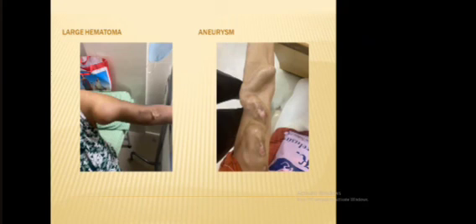This is another patient referred from another place, showing a severe aneurysm of the AV fistula. He came to show this and ask what the problem is, whether you want to close the fistula or create a new fistula or not. The patient is apparently asymptomatic, the fistula is good with good thrill and good bruit, but he just wants to know what should be done for this.